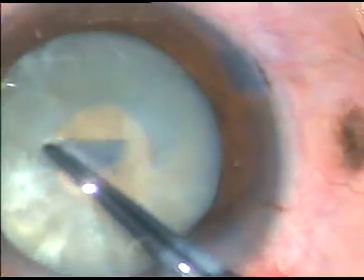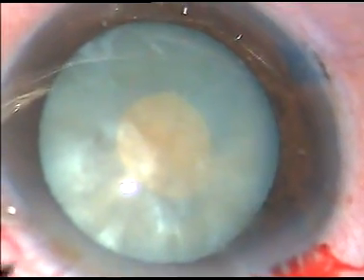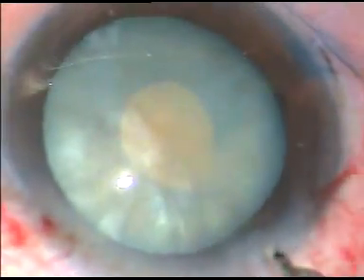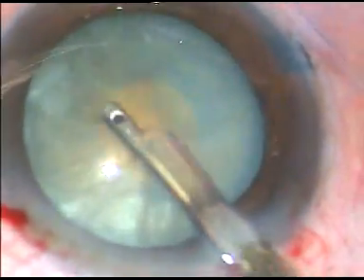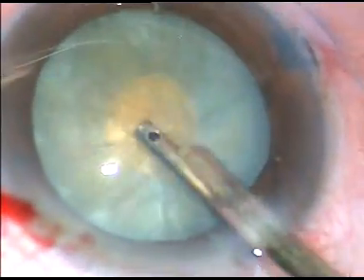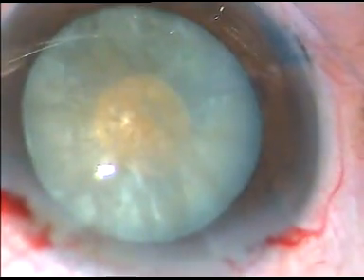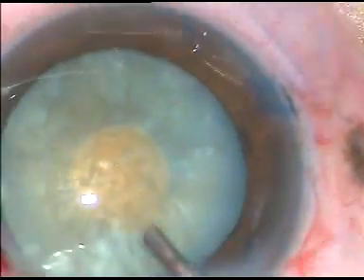If we try to do rhexis in one go, it may run to the periphery. So the safe technique is to do a small rhexis and then aspirate some lens matter through this small opening. You can use bimanual IA; here I am using a Simcoe cannula. You can see that I am squeezing out some lens matter through this small opening, and this is enough — we don't have to remove all the cortex, just enough to decrease the intralenticular pressure to a safe level.